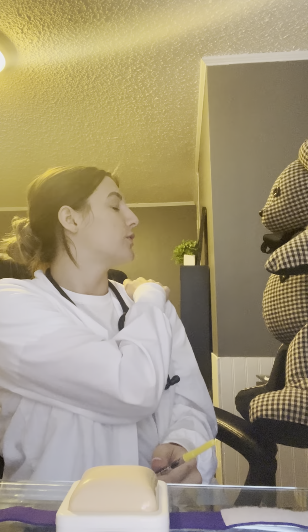For the next one, I'm going to be giving you your TB test. Now, I can do that on your inner forearm or on your scapular for allergy testing, but today we're going to be doing it on your inner forearm, okay? Okay. I'm going to still be maintaining my sterile technique. I have verified all the orders 3 times, checked for the right drug, dose, medication, route, patient, documentation, right time. This was filled already, so I'm giving your TB.